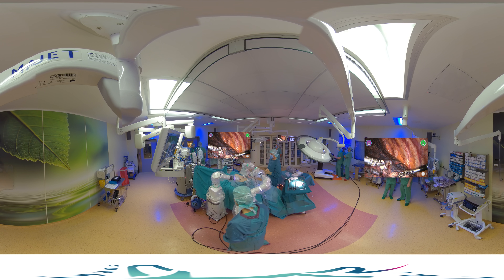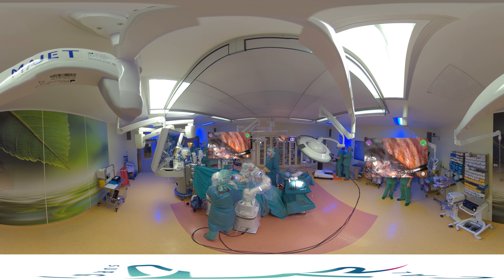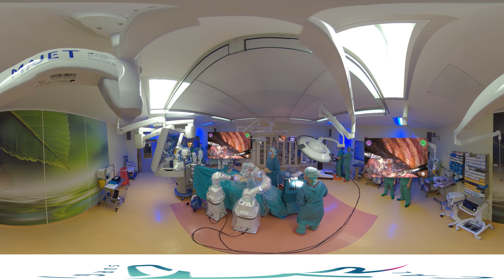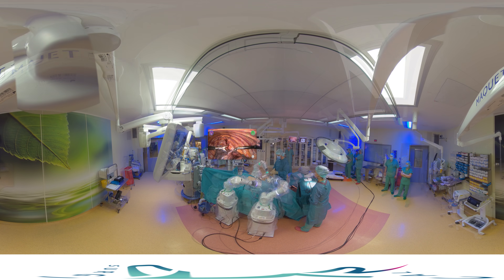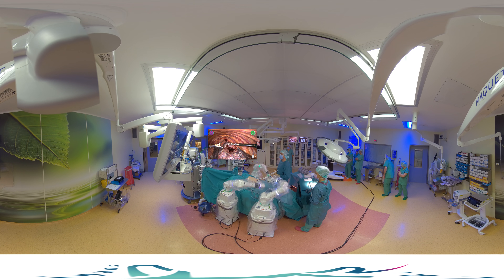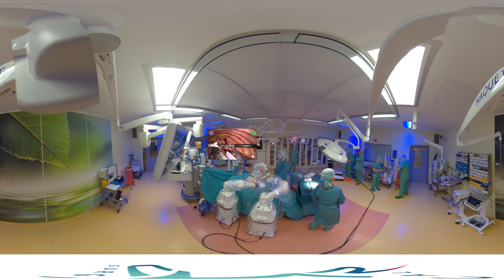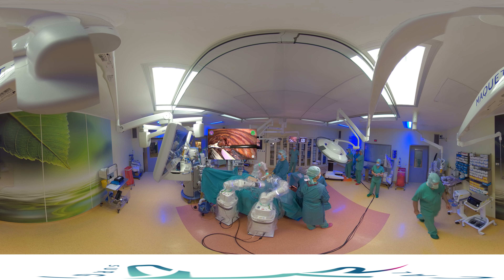Now you have a view from a different angle. You can see the use of the crossbar and the Maryland for the preparation of the fissure. Now the upper lobe is lifted up and the stapler is used to cut off the tumor.